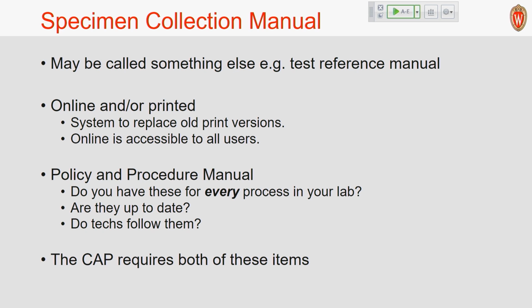And this isn't pre-analytical, it's analytical, but that goes for the policy and procedure manual too. You should really have a procedure for everything you do, and make sure you follow it, make sure techs see it. We actually put a second screen in at our workstations, and the techs have our document control system up, and they can pull up the procedure. Then they have the electronic work card on the other screen. It was not a huge investment, and it's there for everyone to use.